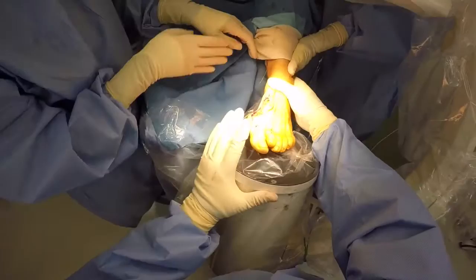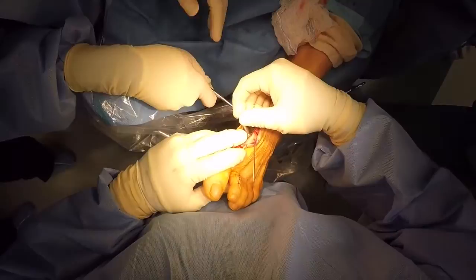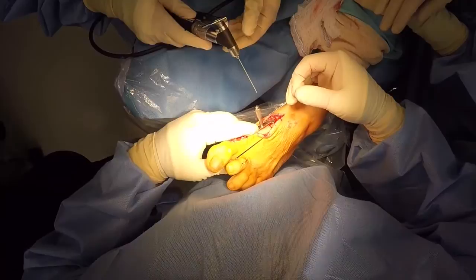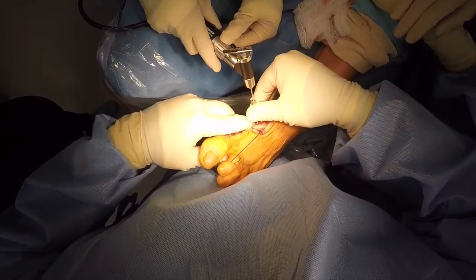So we're checking again under C-arm to ensure that our revised provisional fixation and intermetatarsal correction is adequate. Once we have determined it to be so, we place the template plate for the anchorage CP plate. The template plate has a small tab located where my index finger on my right hand is that is placed into the joint, and this allows for accurate facilitation of plate placement and placement of the reaming wire, which is being placed here.